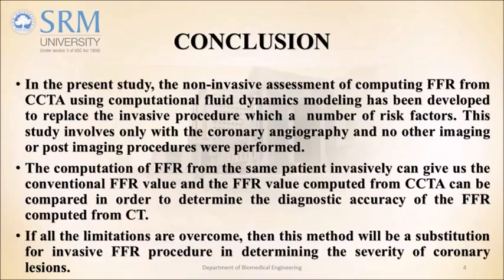In the present study, the non-invasive assessment of computing FFR from CCTA using computational fluid dynamics modeling has been developed to replace the invasive procedure, which has a number of risk factors. This study involves only coronary angiography, and no other imaging or post-imaging procedures were performed.